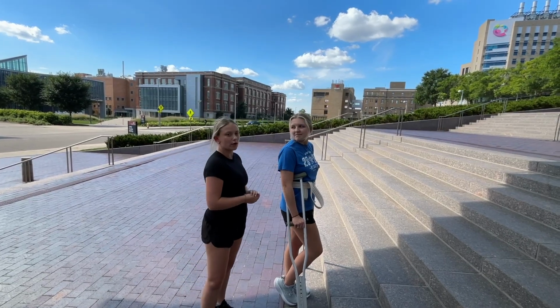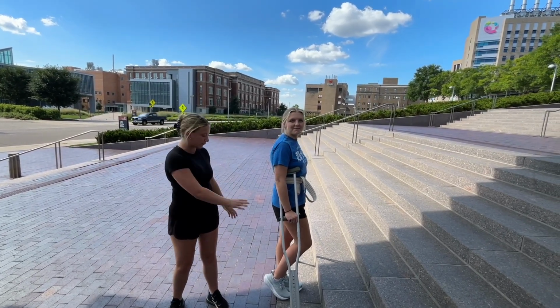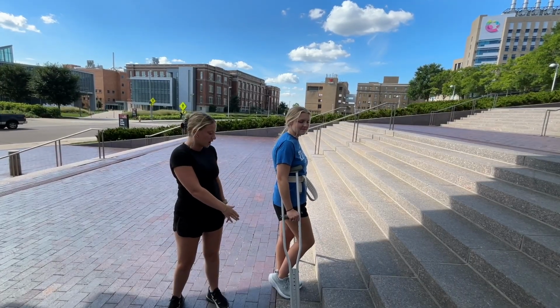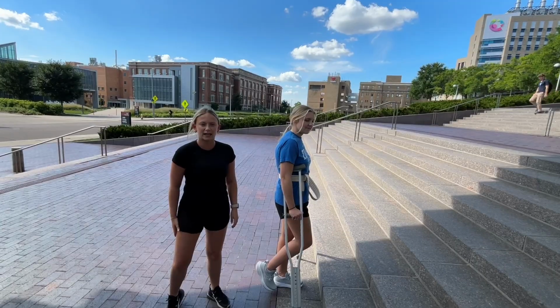Alright, so today we are going to be learning how to go up the stairs using crutches. I'm going to be on the right side of the leg since the right leg is the one that is injured.